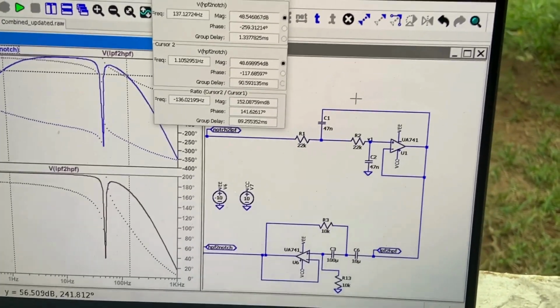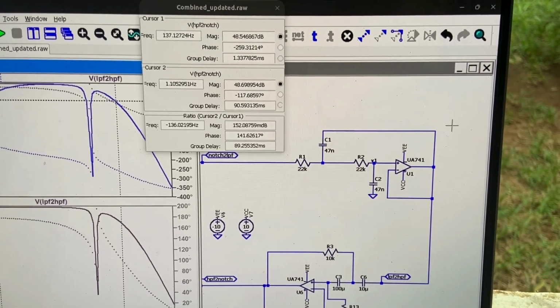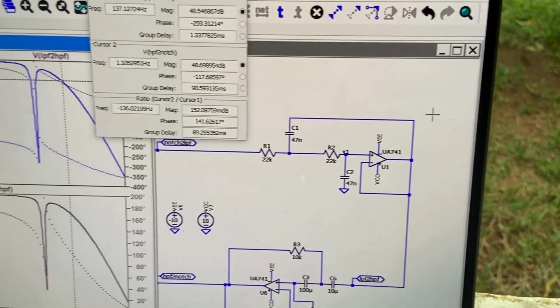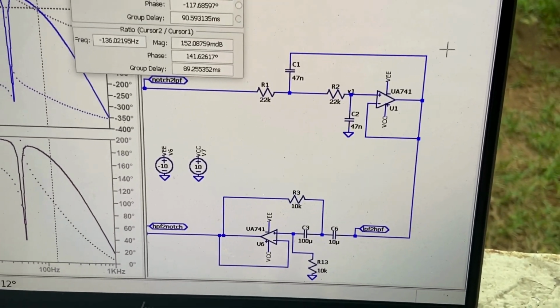Now, this second order active low pass filter essentially consists of a frequency range wherein we are trying to attenuate all the frequencies beyond 150 Hertz. How do we obtain this particular frequency value and how do we obtain these resistor values, R and C values? We essentially use the formula 1 divided by 2 pi RC. This will be explained in detail with derivations in the report.